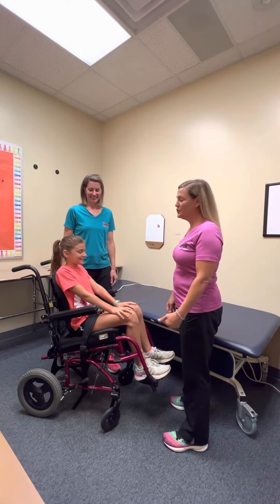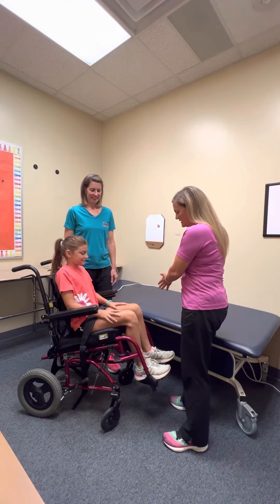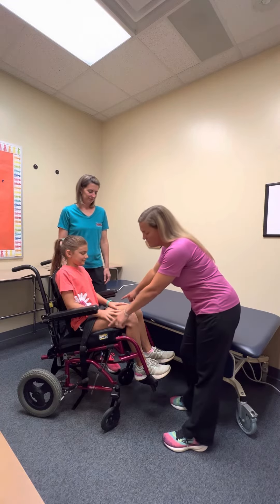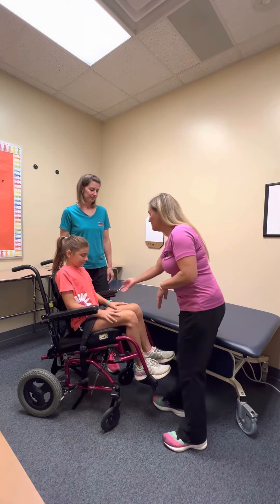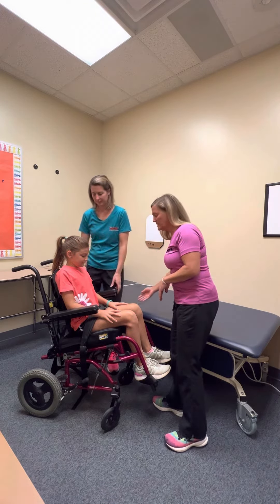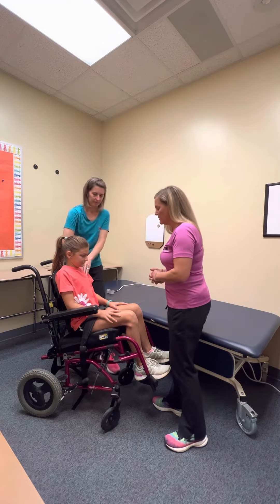This is an example of a two-person dependent lift. You want to position the chair next to the table, lock the brakes, you can remove the chest harness, and remove all the components that are next to the table — so the armrest, and if they had a lateral you could swing that out.